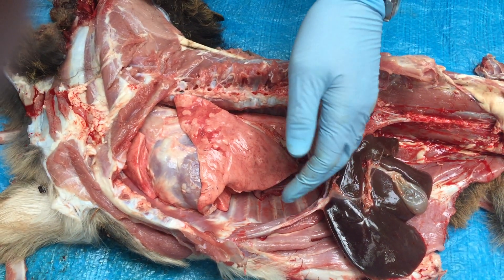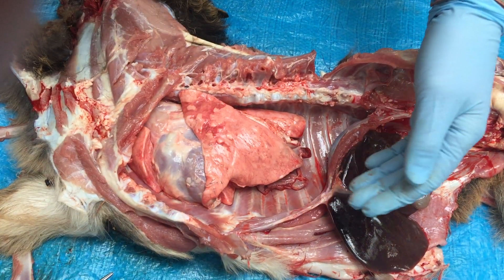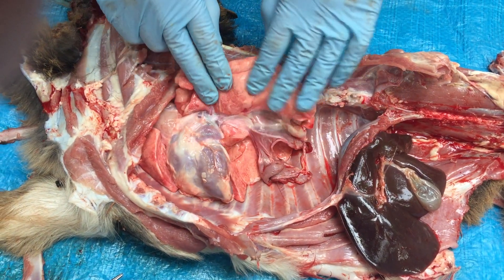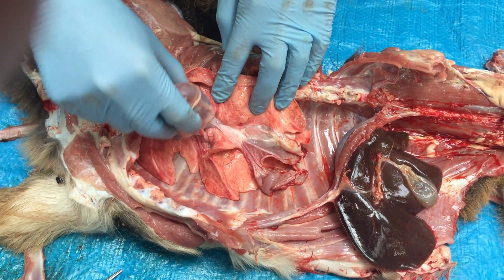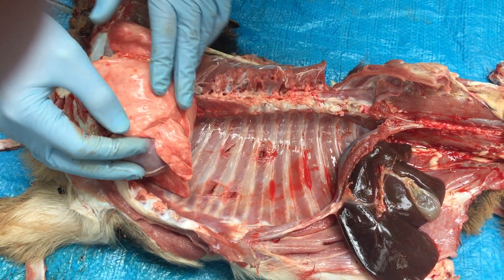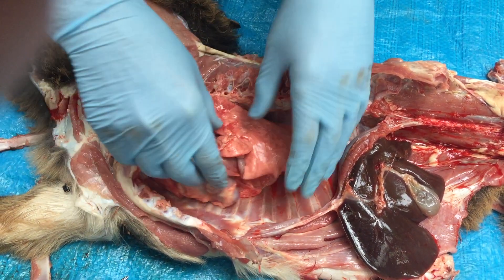Here we have a little goat just shot freshly last night. We've opened up the chest and exposed the whole interior. We've got the left lung here, the heart, and the right lung underneath. They're all still intact.